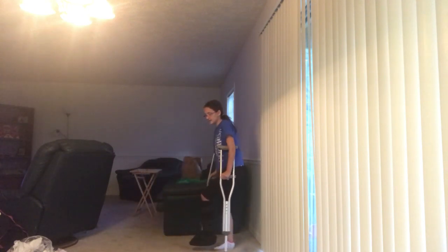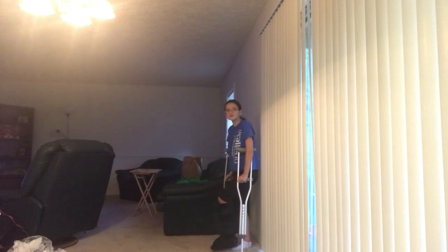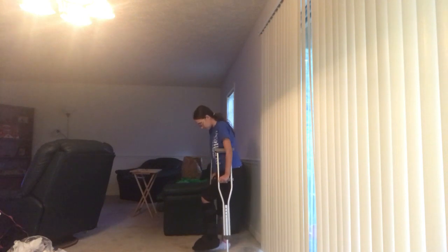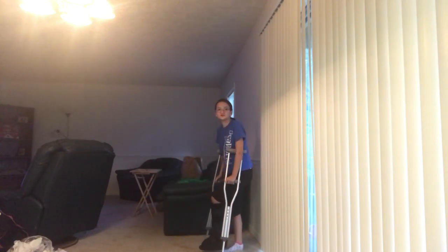When you first get them, especially if you've never used crutches before, you're going to feel kind of out of balance by doing that. You're going to feel like you're going to fall over. So when you first get your crutches, just step with them. Move them and step into them. Move them and step into them. And I don't recommend going backwards when you first get them either.